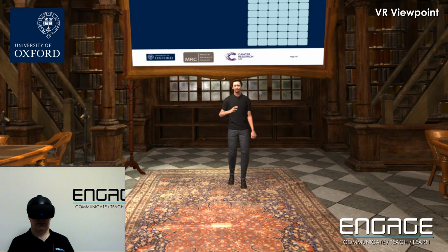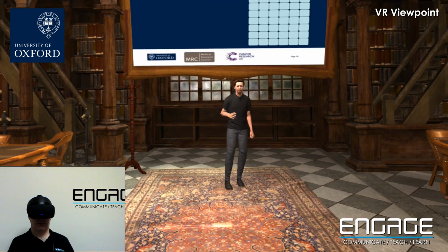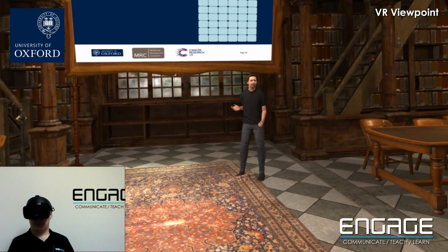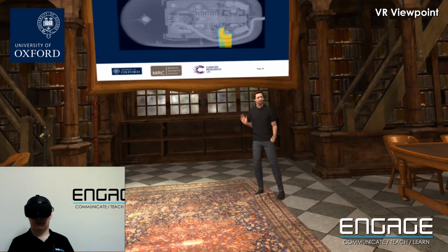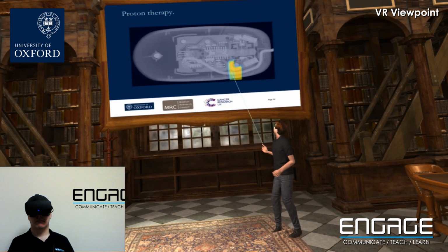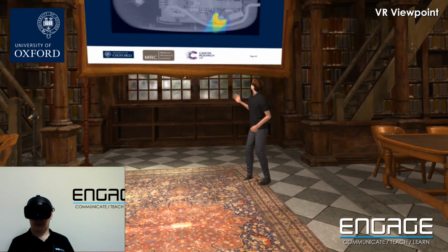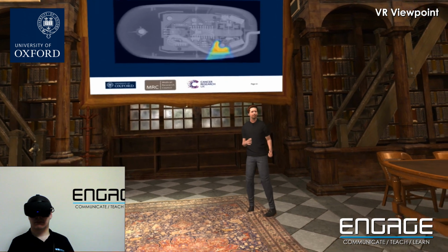And that's really exciting, because if we go back to our patient and look at the way a computer simulation deals with the dose that would result from a proton beam, you can see now that I can still dump a good dose of energy into the tumor, but we can see this organ is starting to be spared. Of course, there's no reason to stop with just a proton beam. We can try multiple beams. And by refining the solution, the physicists can get us down to this situation.